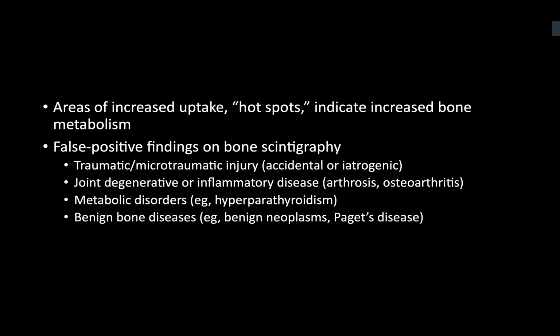Okay. Because this is one of the definite questions that can be asked when there is a discussion on the bone scan, I would suggest making your answer organized. I mean, your answer is right, but to get a good score, we can say that it can be traumatic, it can be degenerative or inflammatory disease, or it can be due to metabolic disorders, or it can be due to other benign lesions.